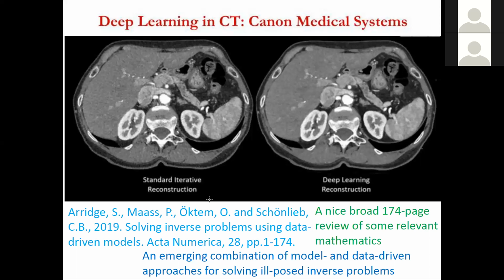You know, that is your dose reduced, and then you have perfect matching because it's every nth event. You don't quite have that with CT, but it's getting close. And if it comes down to it, you can do a second scan, presuming you haven't had any motion in between the two. So as long as the patient still is a phantom, you're all set.